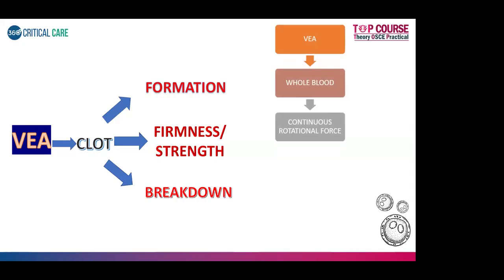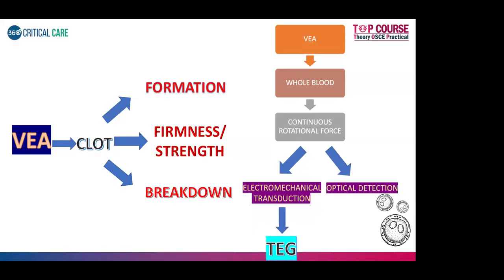For TEG, what is the working principle? What is the working principle for ROTEM? See, your questions are going to be simple like this, okay? I cannot make it another theory class. That's the reason I'm asking you questions. So it's electromechanical transduction for TEG and optical detection for ROTEM, okay?